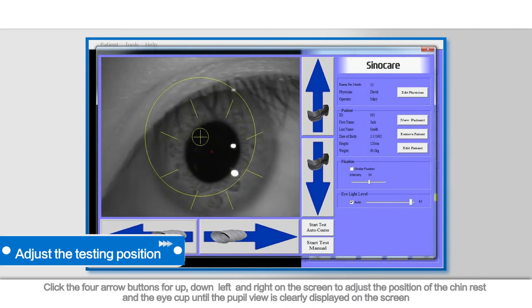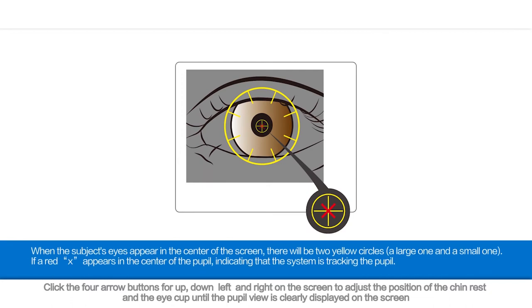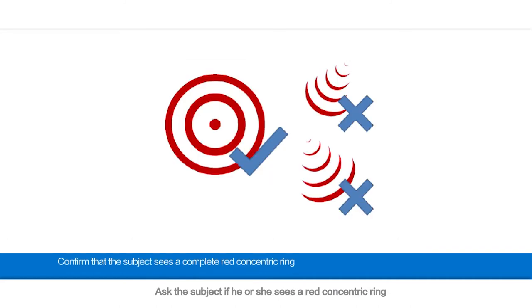Click the four arrow buttons for up, down, left, and right on the screen to adjust the position of the chin rest and the eye cup until the pupil view is clearly displayed on the screen. Then adjust and place the red symbol X into the small yellow circle. Ask the subject if he or she sees a red concentric ring. If yes, follow the steps below to continue with testing. If not, ask the subject in which direction to adjust until he or she sees a complete red concentric ring.